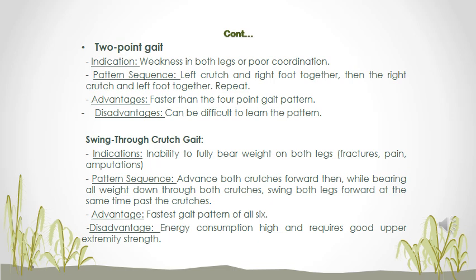Advantage here is it's faster, and it's the fastest of all 6 patterns. A disadvantage here is the energy consumption. It also requires good upper limb strength, so a high energy consumption and grade 4-5 Oxford upper limb strength is required.